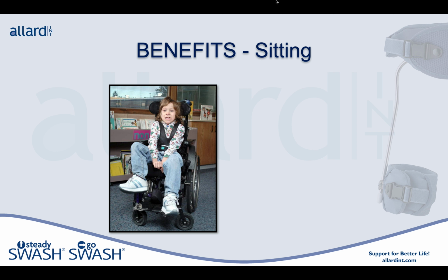Please take a look at this young lady's facial expression in her seating system. Please note that she does have a pommel. There are straps to keep her feet positioned correctly. She's got a harness that basically forces her into her seating system. And just look how uncomfortable she looks.